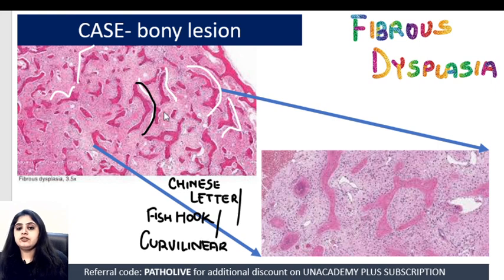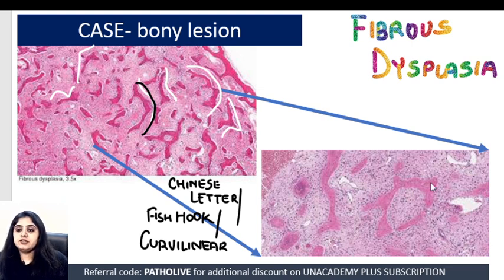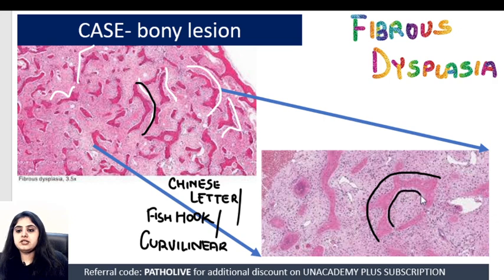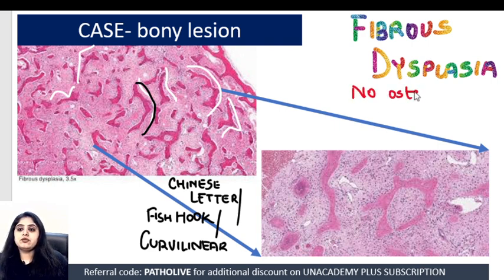Now looking at the higher magnification — have a look at this bony trabeculae here. It's again a very weird shape, like a Chinese letter. But notice it's all pink. Do you see any line of cells around it? You do not. This means it is not lined by osteoblasts, which is a very important finding.